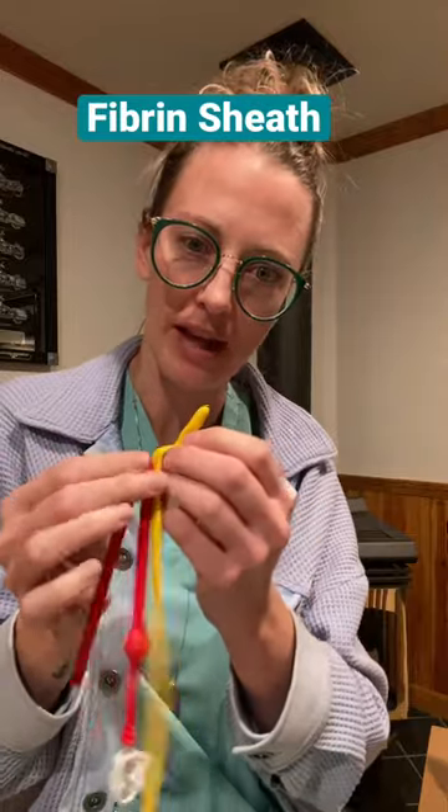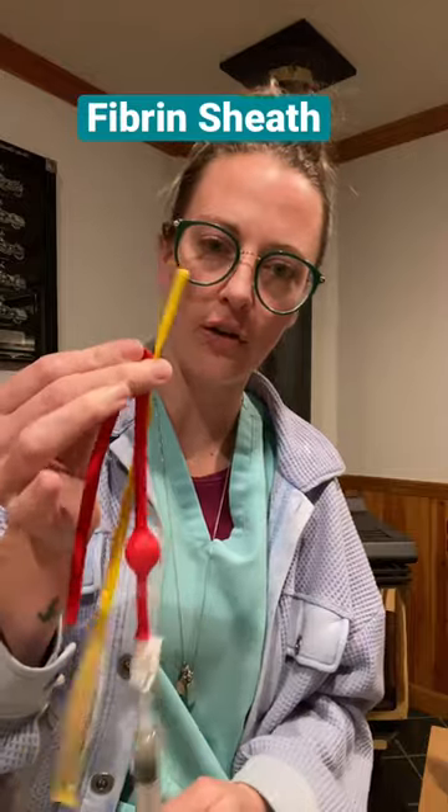What happens with a fibrin sheath is it's essentially like a protein tail that forms on the tip of the catheter. The tail wakes and goes around in the direction of the blood flow.